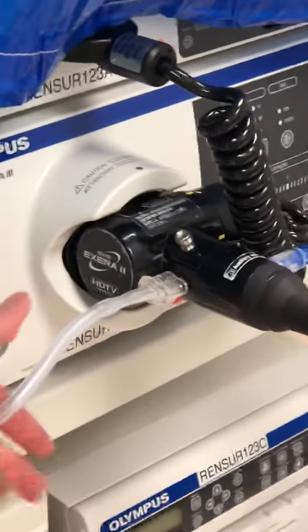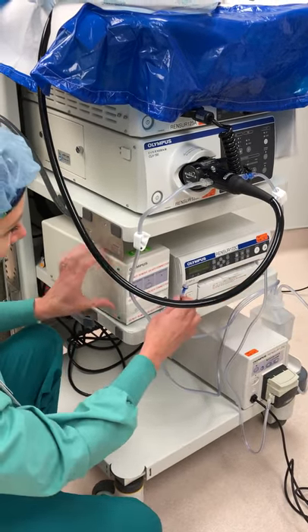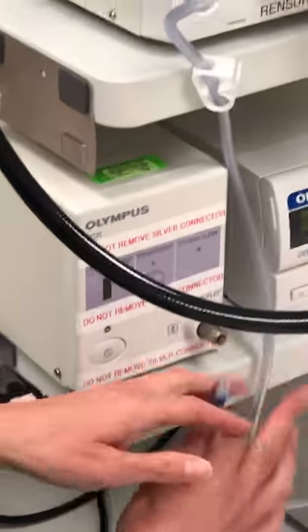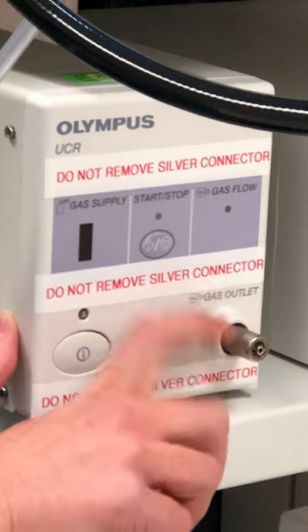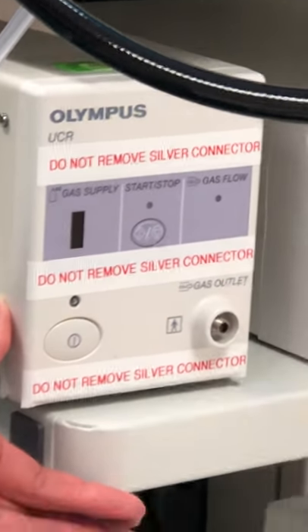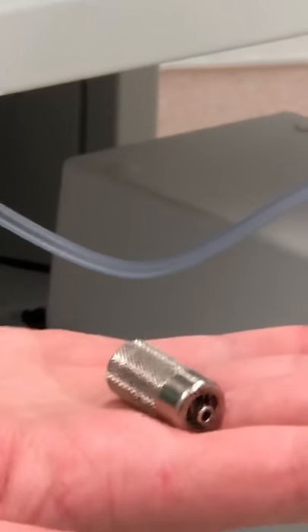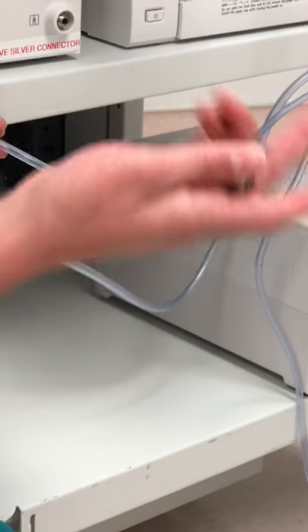Make sure it's tight enough. This last one is for the CO2 tank. There have been a lot of issues with that — as I can see, somebody has made a point to label your insufflator pump: 'Do not remove silver connector.' This piece right here is the silver connector. It will screw right off, so be very careful with this — do not even take it off of this pump.